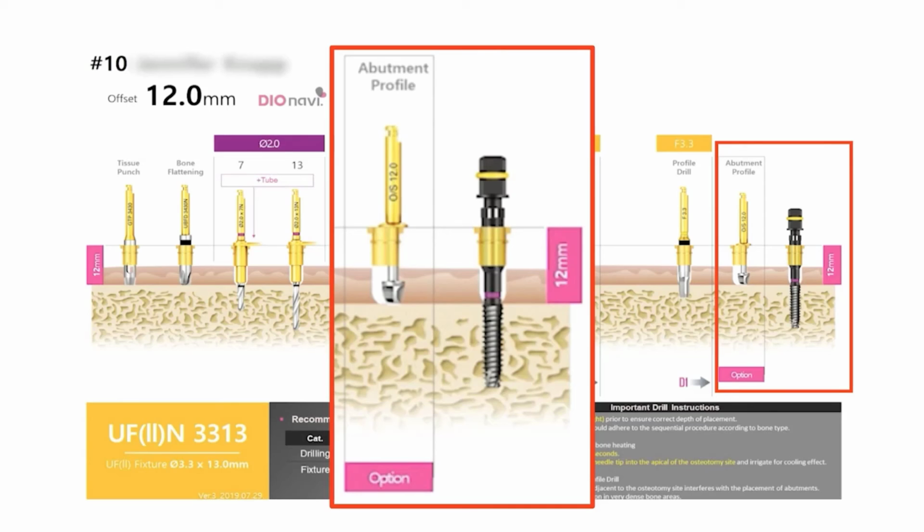I wonder if I should have used that. And so that was maybe one other thought I just wanted to bring up in the post-operative conversation. I don't think it's wrong to use this every time if you want. I typically only use it when I feel like the bone is very dense and definitely going to be in the way of some type of abutment I'm going to be placing. And I think I guessed wrong today on that surgery. That abutment drill probably could have been used, should have been used, and it would have been helpful.